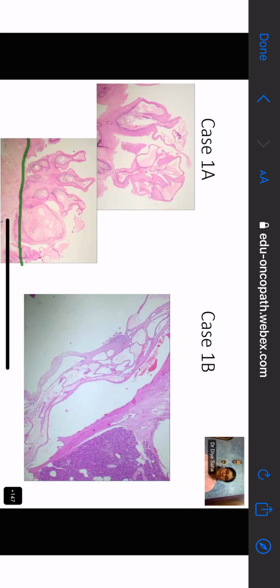So they are above. So everything that you see in pathology that is above the surface is a papilla. Is that what you're saying, Dia? No, ma'am. Not always. Not always. All right. But this, according to you, is a papilla. Why?